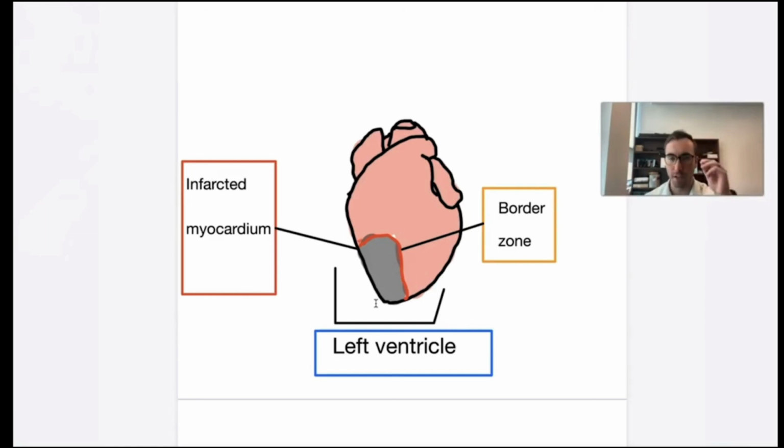In Dr. Cheskes's study, it was demonstrated that in comparison to standard defibrillation, vector change for patients in refractory ventricular fibrillation and pulseless ventricular tachycardia had a higher likelihood of converting. It wasn't significant, but it was enough to say this is doing something. That's why the ILCOR guidelines recommend doing it after the 3rd consecutive shock; even though it's low quality and low certainty of evidence, there does not appear to be a detriment. So it's a very interesting point at this time, and obviously more studies are needed, but again, the problematic factor is the bottom portion of the left ventricle does not get depolarized enough.